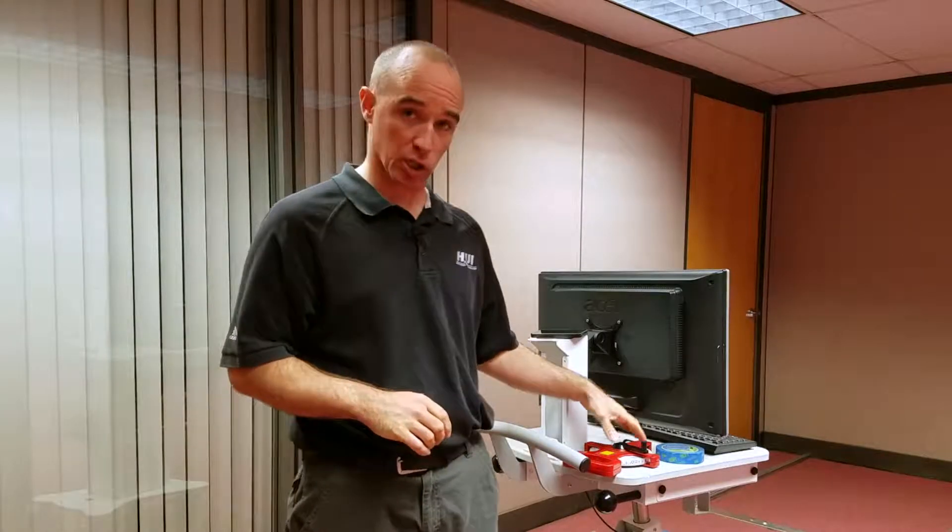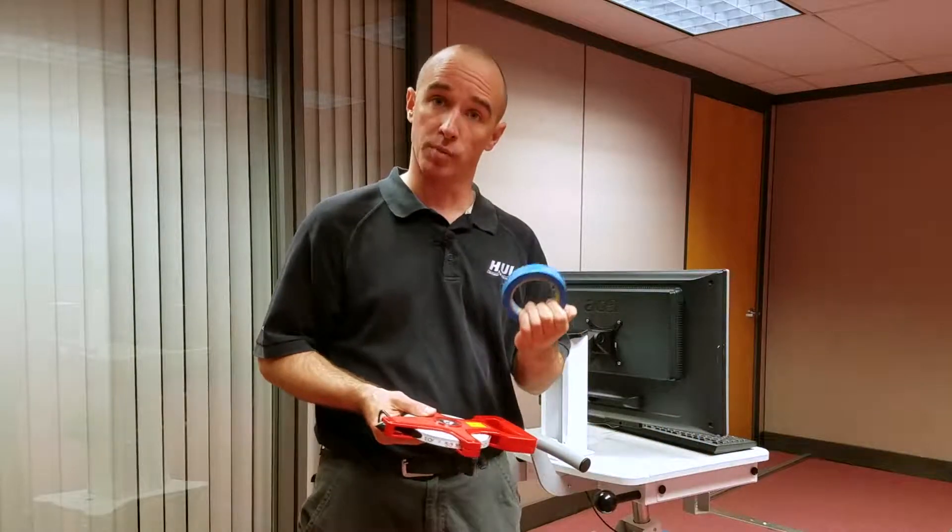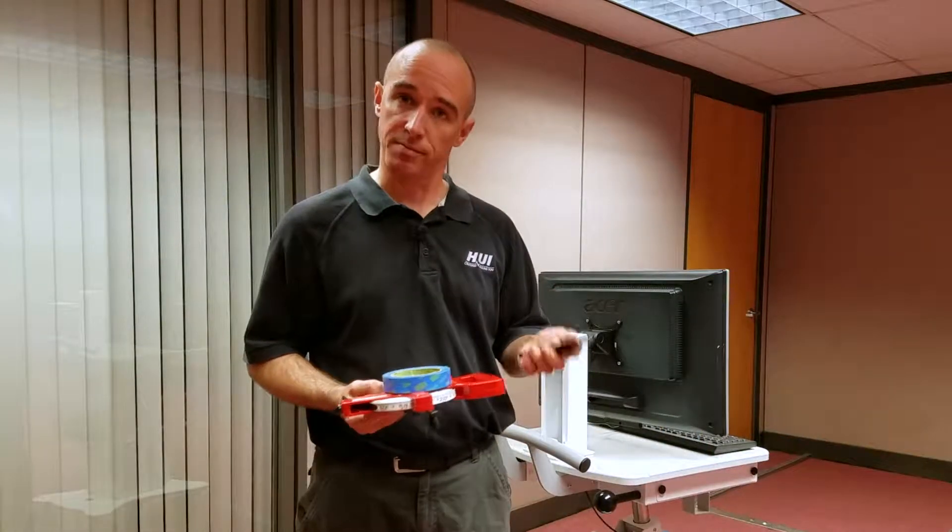Materials I use to conduct this test include a threshold, a large tape measure, a roll of masking tape, and an app on my phone that I use as a metronome.